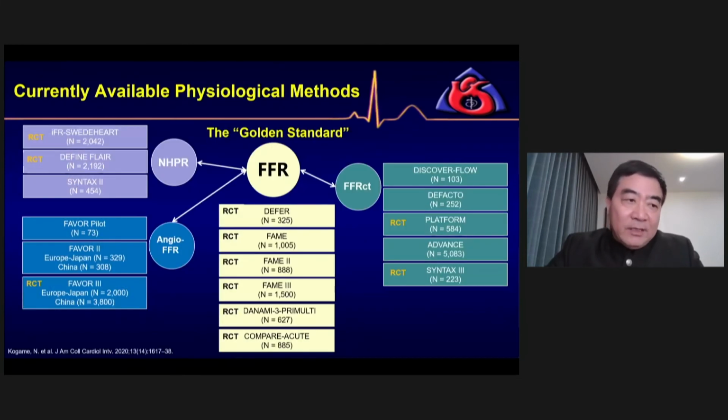Multiple randomized trials showed the benefit of FFR in guiding PCI versus conservative therapy, especially in intermediate lesions.